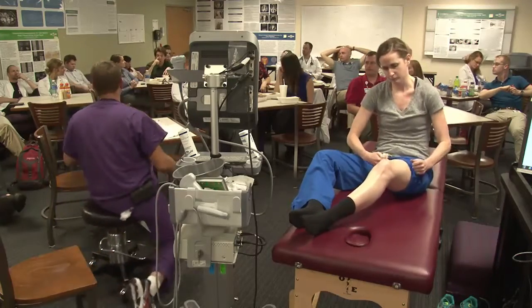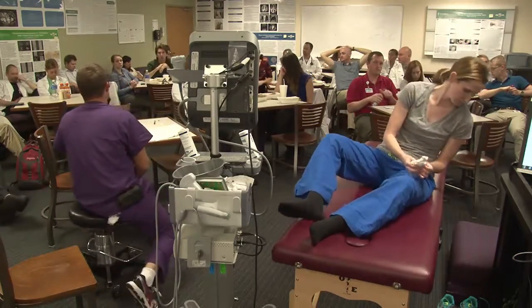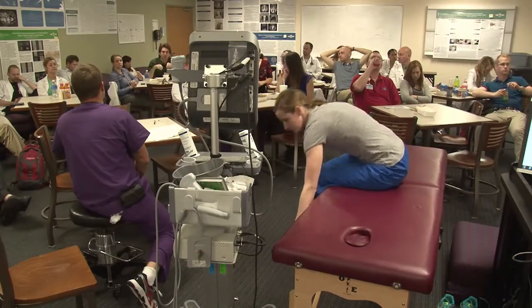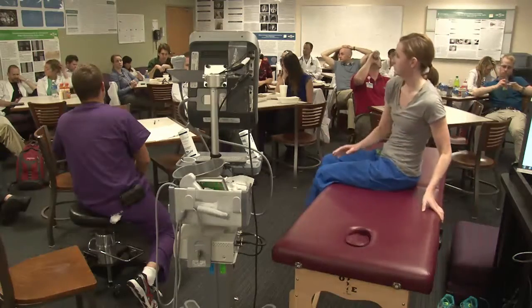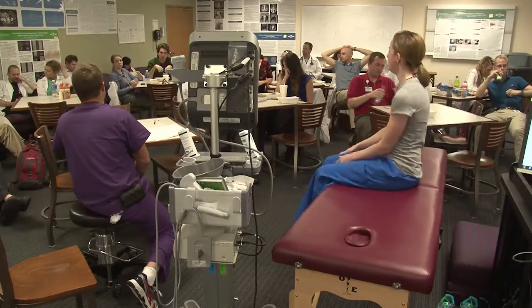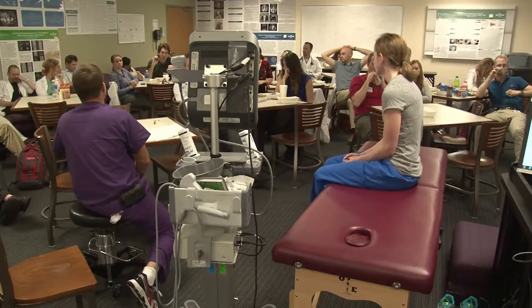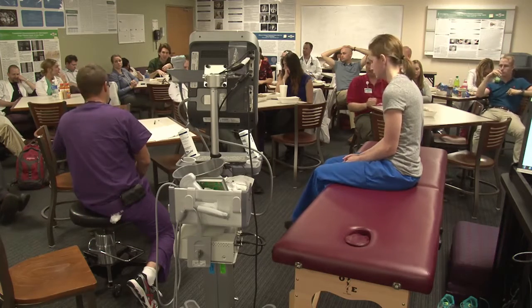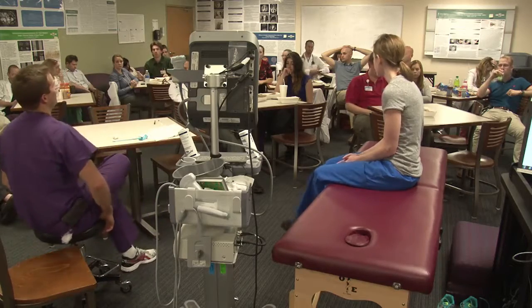Yes? Apart from using the ultrasound to just find veins when you're trying to do peripheral IV access, especially at night, so we don't have to call you guys in, do you use like an inline or short axis view to actually place the IV catheters? We've tried that, but then we have trouble once we get it in. The catheter itself is not picked up on the ultrasound, but the needle is. So I just want to know if you have any technical tips to help maneuver those things.